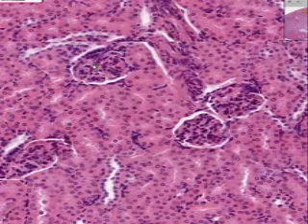The problem is, really, in all honesty, at 20 power on an H&E stain, you often really can't differentiate between those 3 types of cells easily. But if you did special stains or had EM, you could see beautiful differences. Otherwise, you could say this is a distal tubule. These are proximals. Here is the urinary pole of the glomerulus.